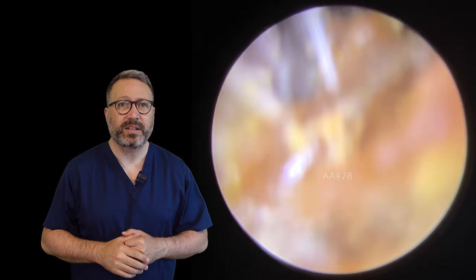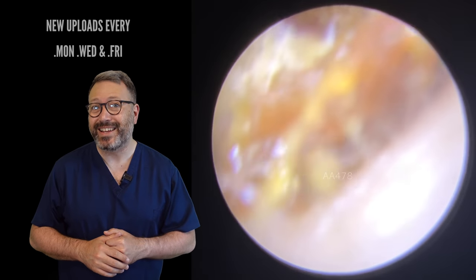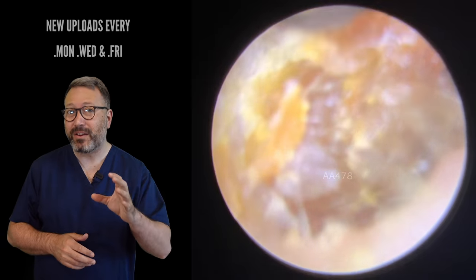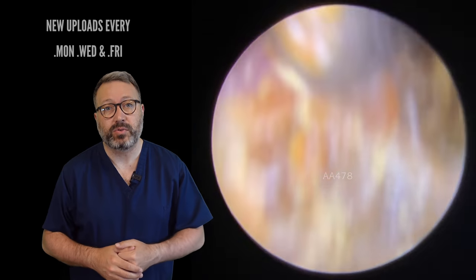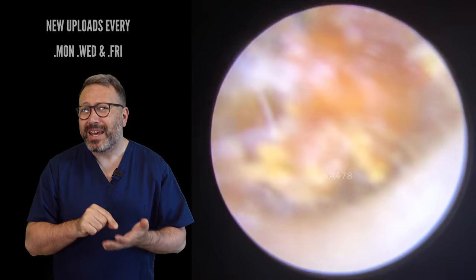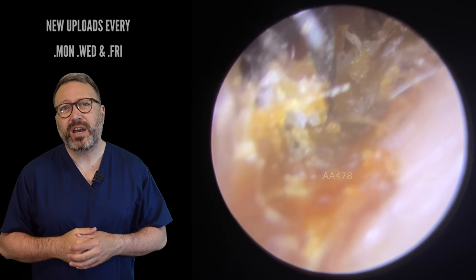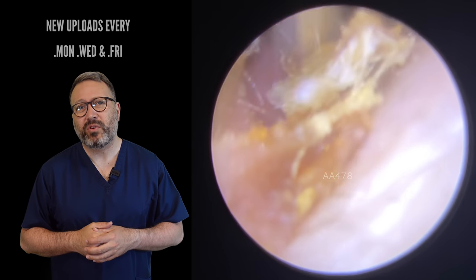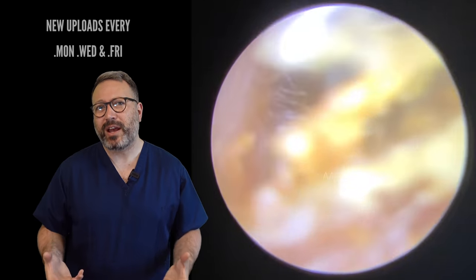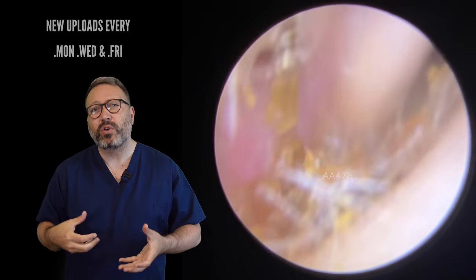You can see me unpeeling this from the side of the canal wall. Very, very slowly and gently taking this away. Don't forget the outer parts of the ear canal are quite sensitive, so if you push a little bit too hard against that skin it can be really uncomfortable for the patient — it can feel like a sharp scratching sensation. So you'll see we're just very, very slowly drawing this out using that harder outer shell of wax to hold on to and draw this out.